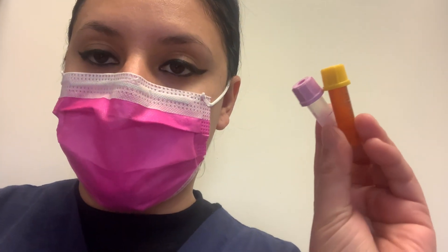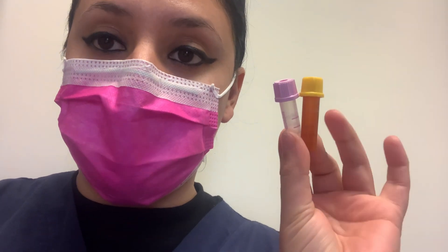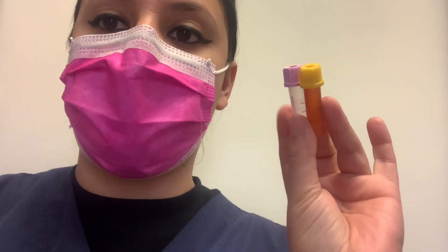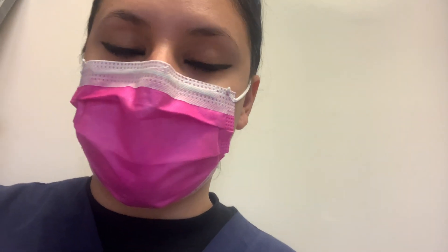Remember you always have two pokes, but if you're having trouble you could always do a finger poke instead. There's a minimum volume, so you can use these tubes for the chemistry tests and the lavender for the hematology test — which is the CBC and stuff like that. It's really good to know.